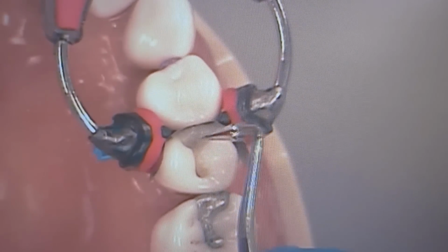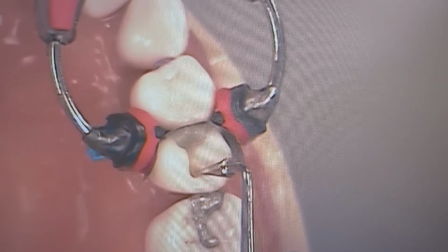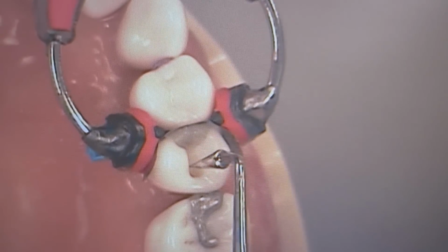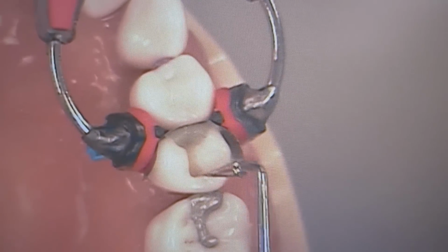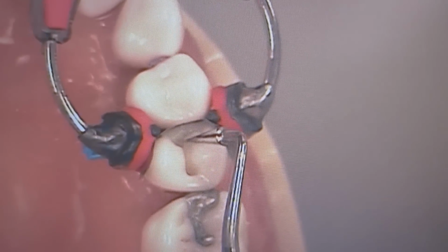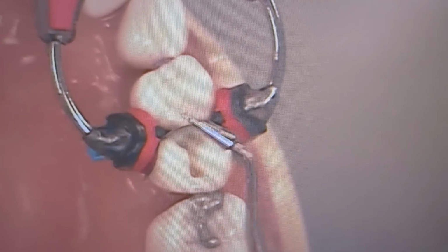It's why we have you make a larger preparation, because it's easier to restore. I'm using the tip of the instrument to press it down into the box first. Okay, using the tip of the instrument to press the composite into the bottom of the prep. I'm removing all this excess. Removing the excess.